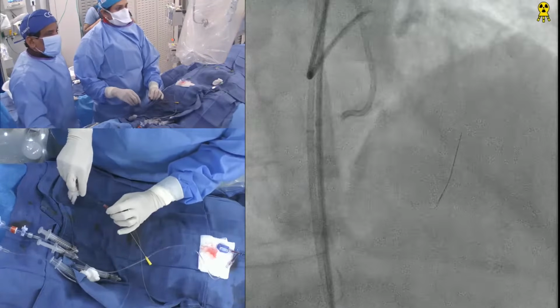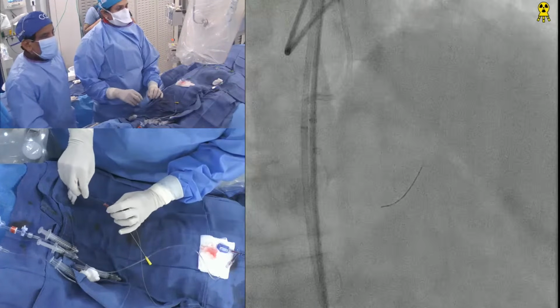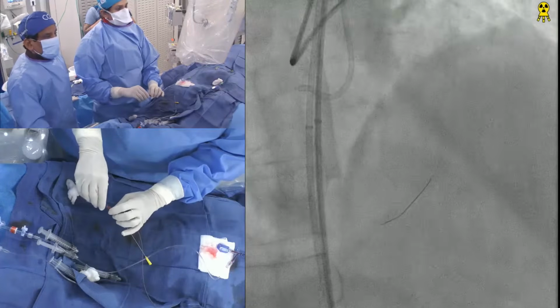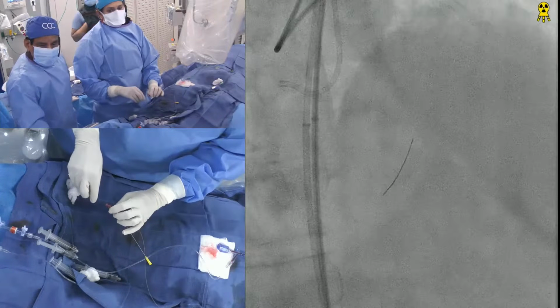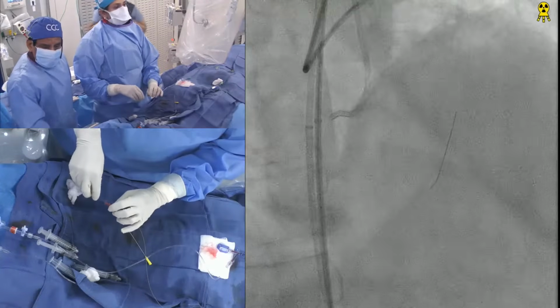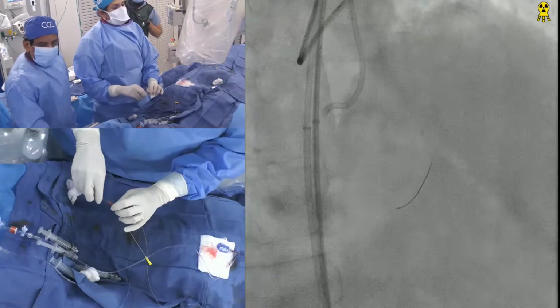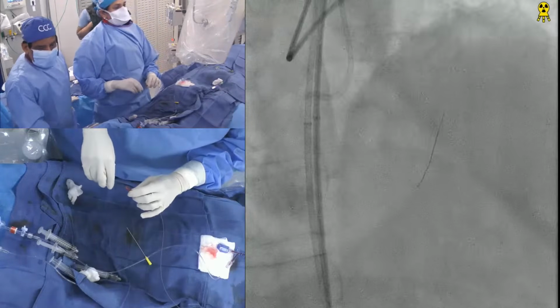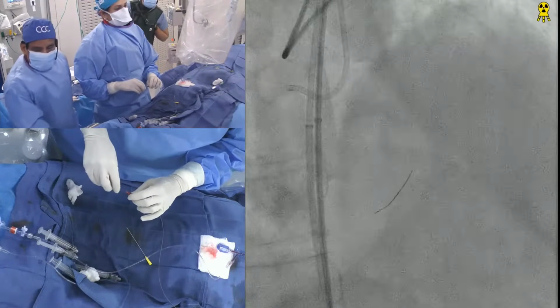RCA. What is the SUO 03? Actually, yes, we have that. You can go on the GuideWire website and just check it. Yeah, we have SUO 03.